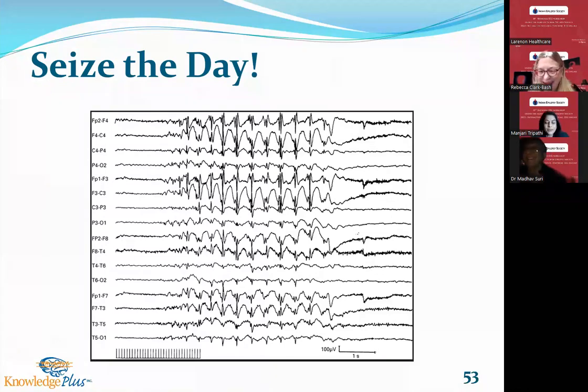The last question by Dr. Ram is, beyond what time would you consider hyperventilation-induced slowing or changes abnormal? Yeah. So we're going to look at what we saw in our pediatric population, in our adult population. We saw theta range and delta range in that seven-year-old. So is that abnormal? It's not abnormal unless it extends beyond that 60 seconds, that 1 minute. Once it's still continuing, we have to look for the source of that. And I think it's fair, given the history, it's easy to ferret out that it might be hypoglycemia. But if it's not hypoglycemia, now we have a bigger challenge, right? Now we have to look to imaging as to why they would have less than optimal posterior dominant rhythm.